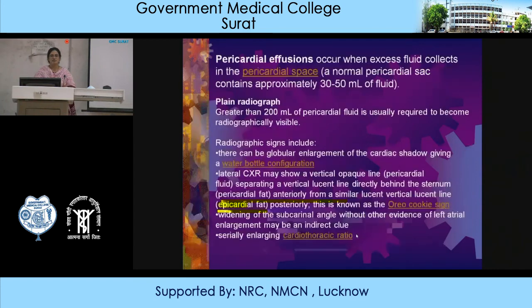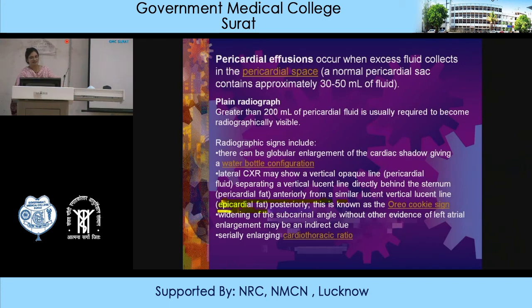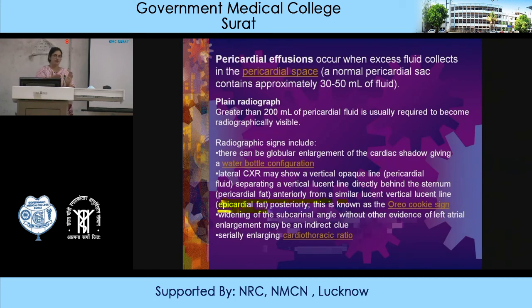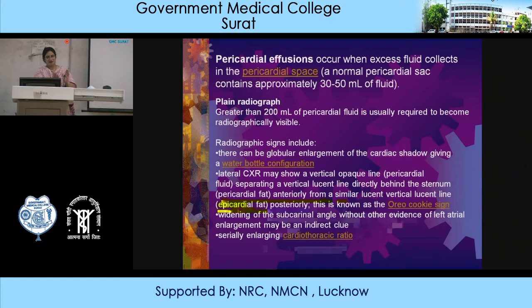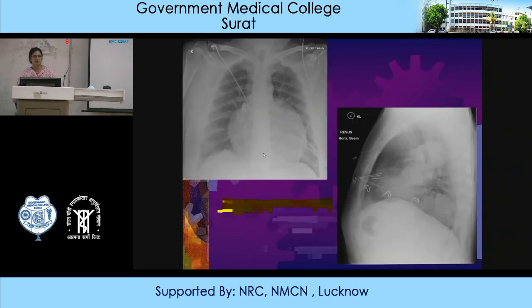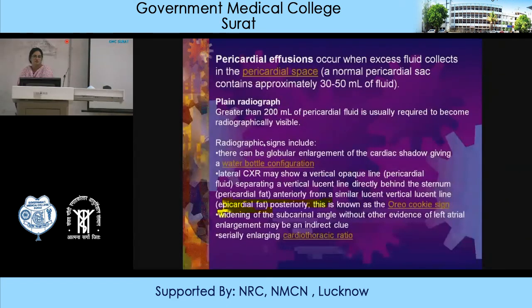Pericardial effusions occur when excess fluid collects in the pericardial space. Normally the pericardial sac contains 30 to 50 ml of fluid; more than 200 ml will be visible on chest X-ray. Radiographic signs include a water bottle configuration with globular enlargement of the cardiac shadow. On the lateral chest X-ray, a vertical opaque line formed by the pericardial fluid differentiates a lucent line behind the sternum (pericardial fat) from the opaque fluid and a posterior lucent line (epicardial fat) — this is known as the Oreo cookie sign. Widening of the subcarinal angle without other evidence of left atrial enlargement also indicates pericardial fluid.